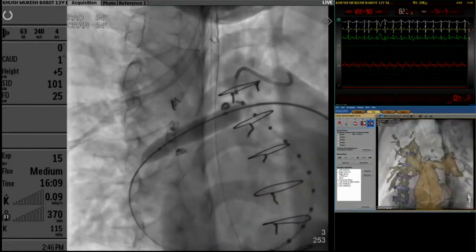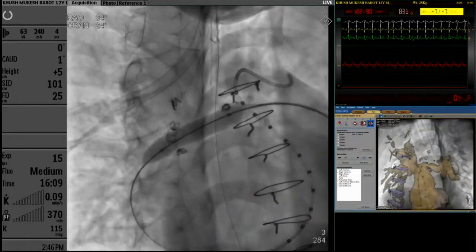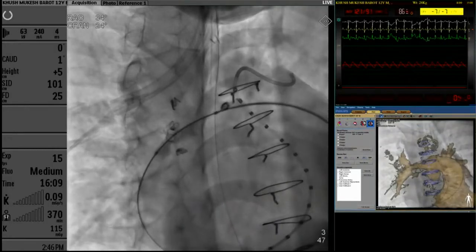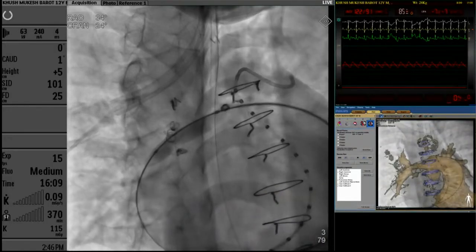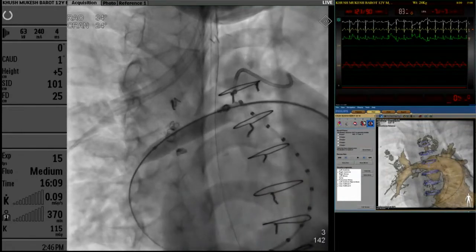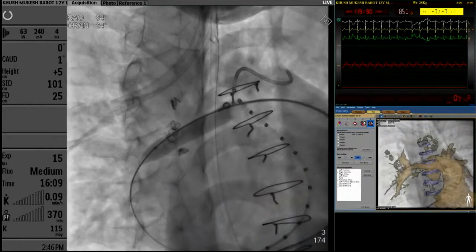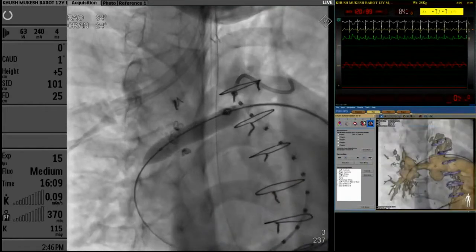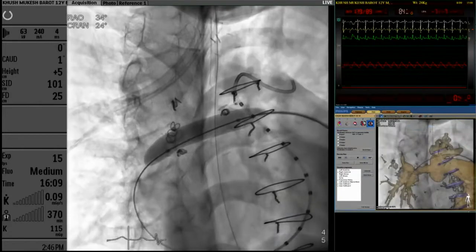Now, if I had taken a Cook formula, the Cook formula's burst pressure is 10. So probably we would not have been able to eliminate this waist if it had been a Cook formula primary stenting. This Mustang balloon, till around 12, continued to retain a waist. And then once we crossed 14 and 16, it opened up fully. Next picture. So then we dilated the entire right.